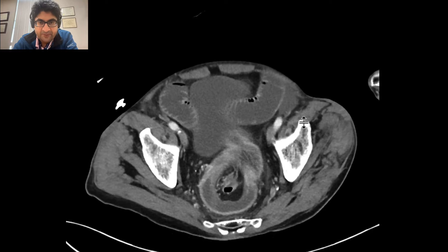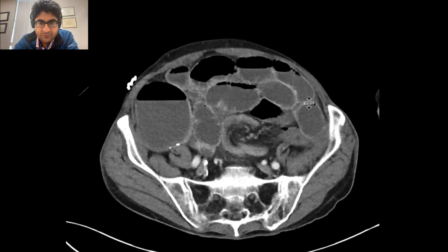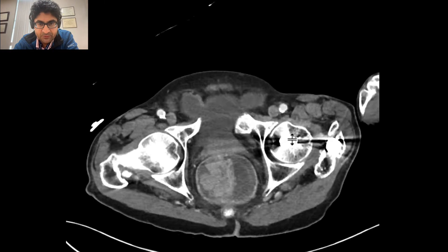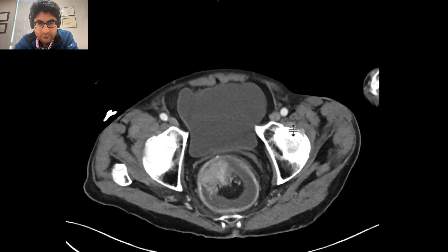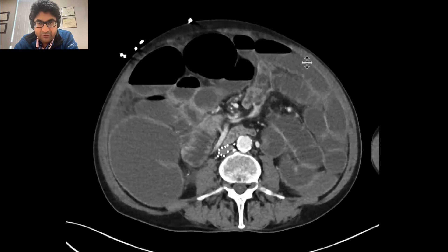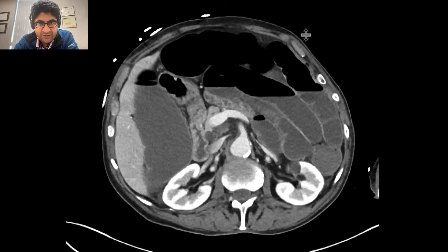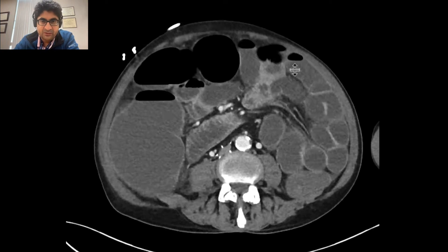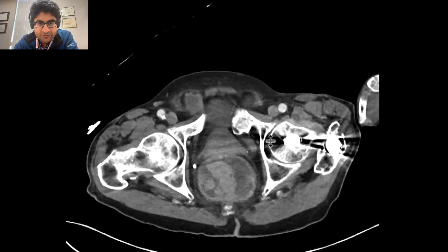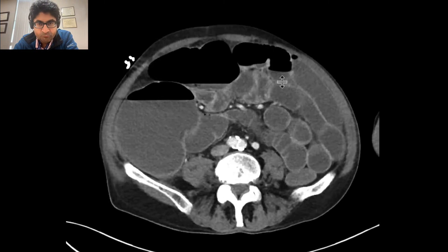You can see right here that fat and vessels and other content is being herniated into loops of bowel, and that's resulting in a large bowel obstruction. This is a nice example of a colonic mass that's turned out to be an adenocarcinoma of the colon, resulting in intussusception, which resulted in a large bowel obstruction.